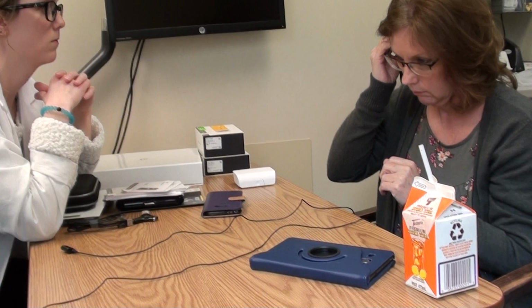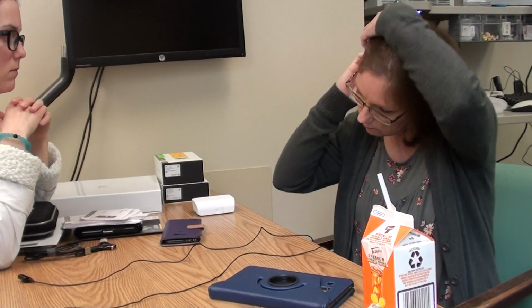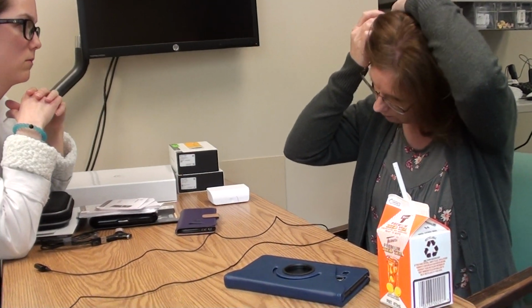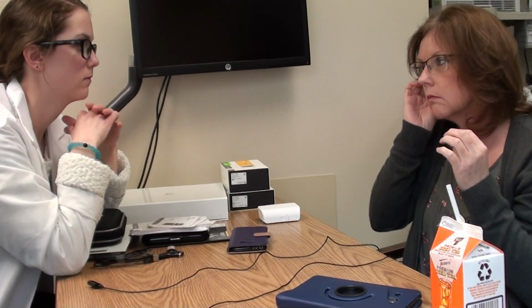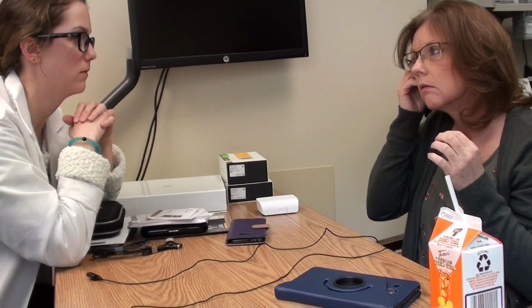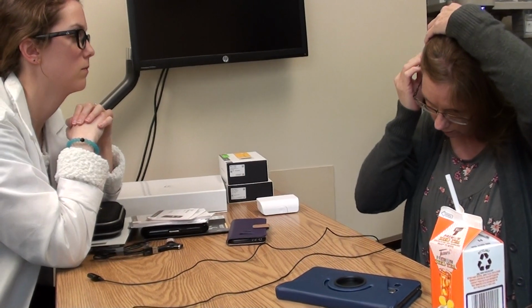Yeah, she doesn't need the ear mold anymore. I know. But if it's comfortable and makes her feel like it's there and more secure, that's totally fine. So we definitely have patients that wear ear molds with them. Well, she might get used to it and then take it out. But I guess she wore it for so long. Yeah, it feels weird without it. I believe it for sure.